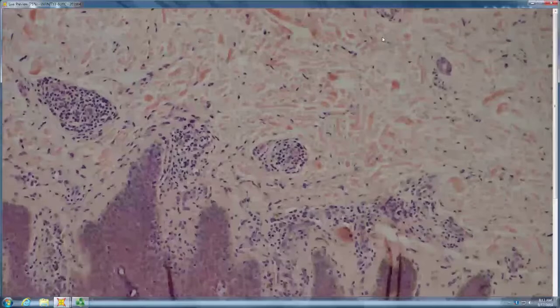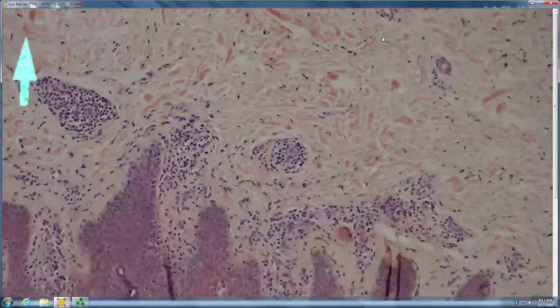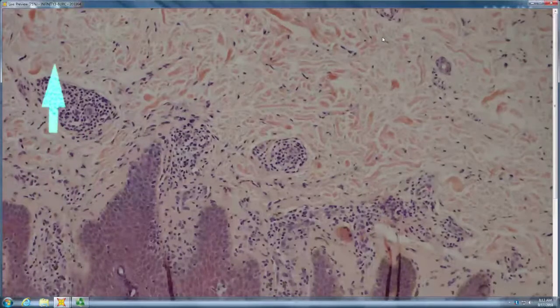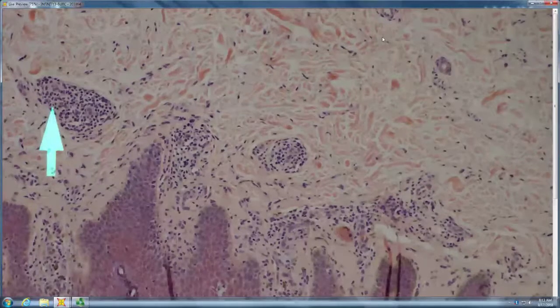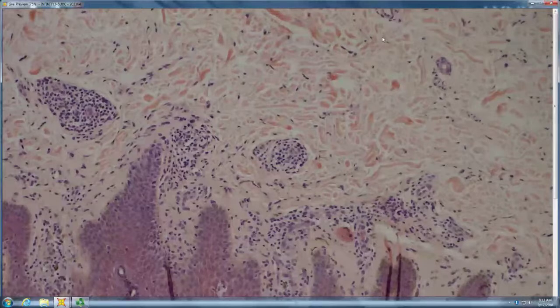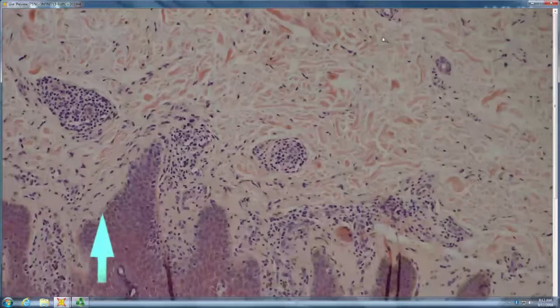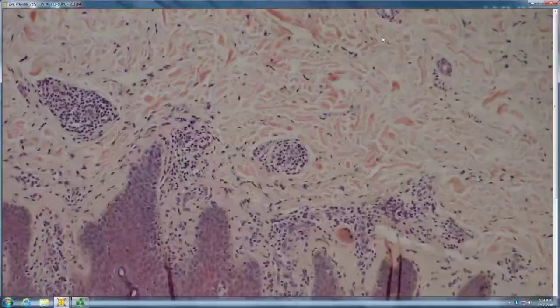There's an infiltrate around the vessel, nice and symmetrically all the way around the vessel, just as much under that vessel as there is above that vessel? No, not so much. No, it looks like a bare underbelly, and papillary dermal fibrosis. Yeah. And what are these lymphs doing, kind of lining up at the DE junction? That looks like MF. It's like maybe early MF.